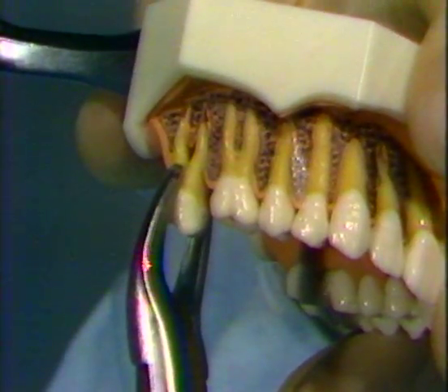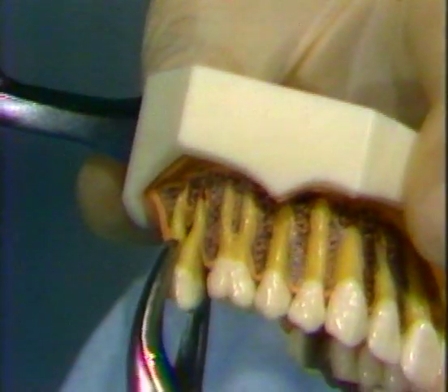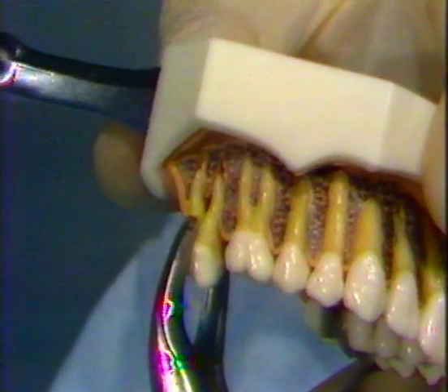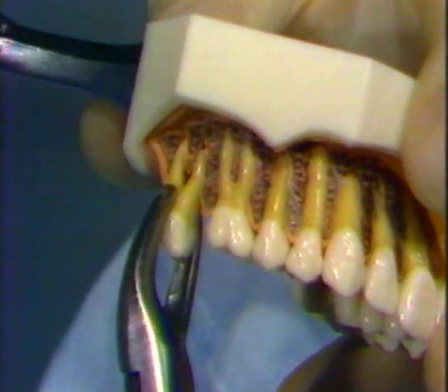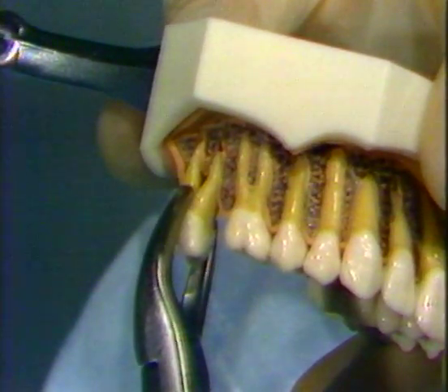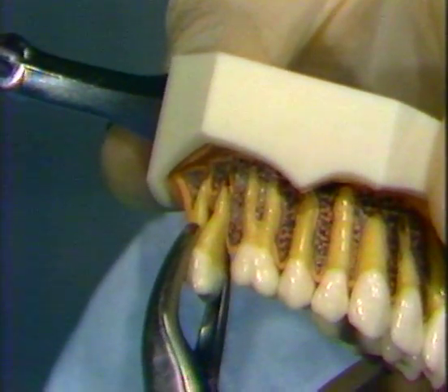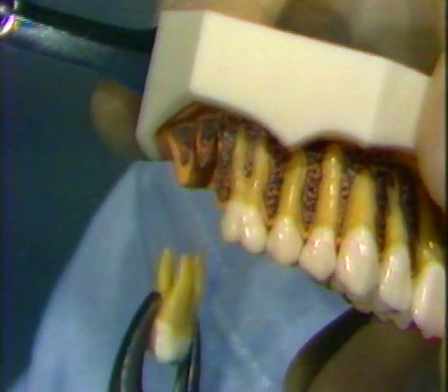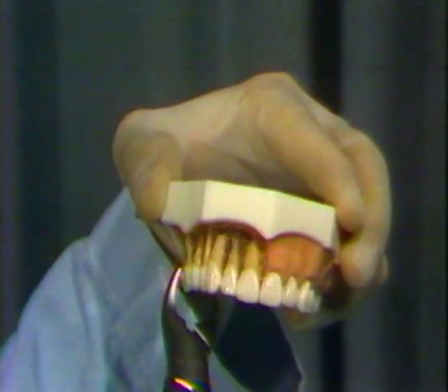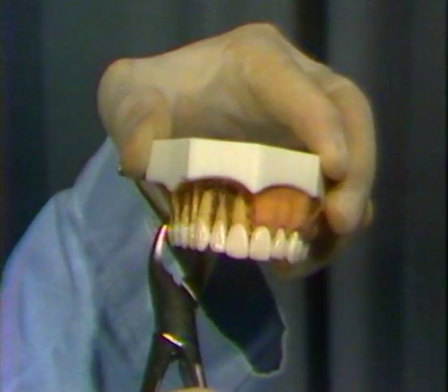The first movement is to the buccal. The next movement is downward and palatal to avoid driving the palatal root into the maxillary sinus. The buccal movement is then repeated more forcefully. The tooth is then subjected to slight mesio-distal rotation to enlarge the alveolar socket. This is followed by a downward and slightly rotating movement to allow the tooth to find its own path of removal. To better visualize the motions applied with the forceps, the demonstration will be repeated from an anterior-posterior perspective.